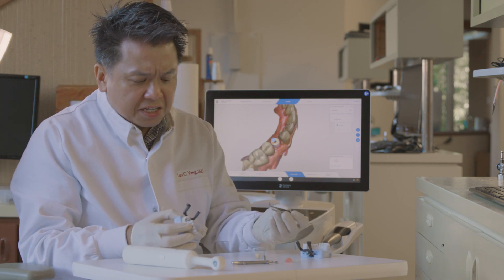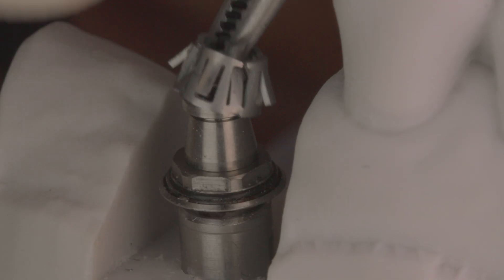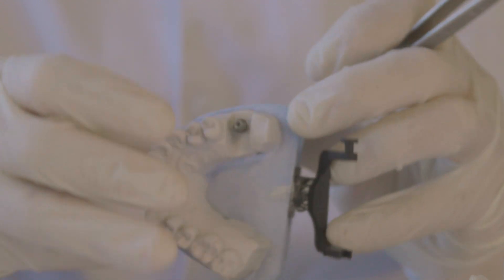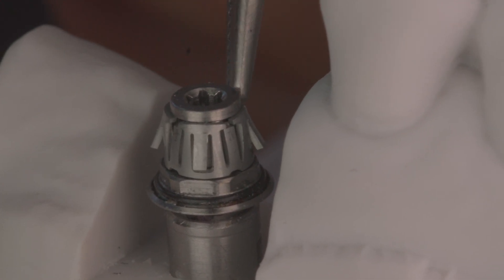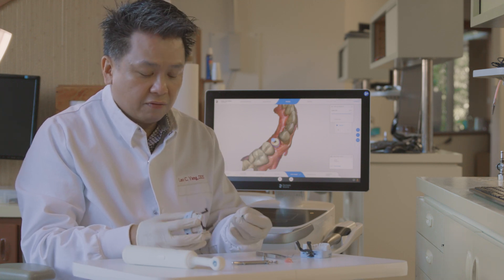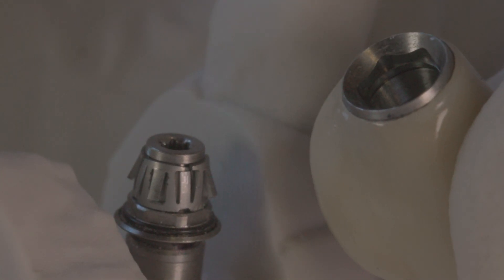The next thing I'm doing is picking up my Smileloc with a pair of cotton pliers. I'm going to engage it into the RODO abutment and push it down with my fingers. You need to make sure that the Smileloc is seating all the way down, because you'll see a little collar at the tip of the abutment — you need to make sure it seats over that. Once that's in place, it's just snap on. You can see the internal aspect of that coping and how the Smileloc locks onto it.